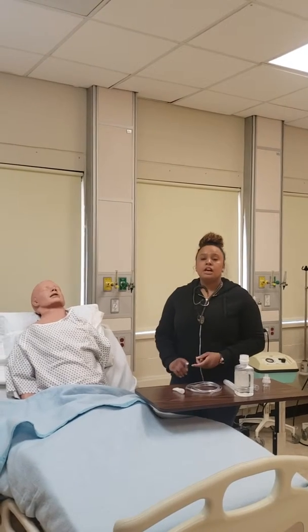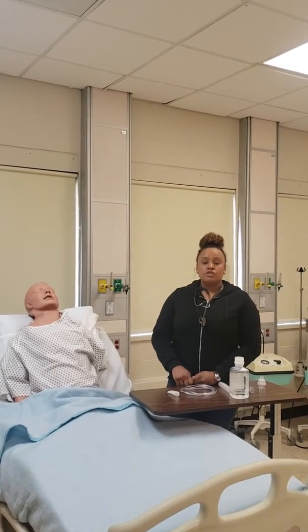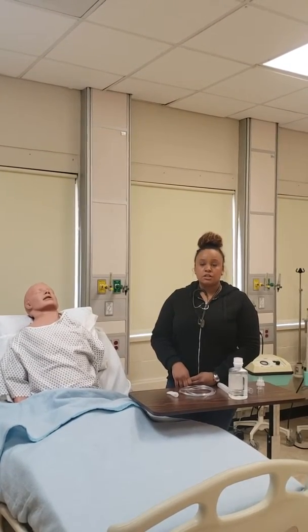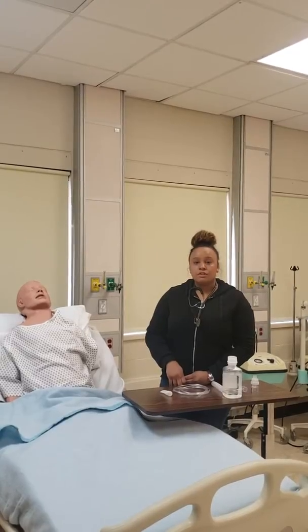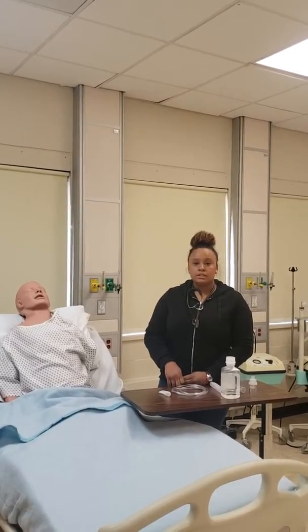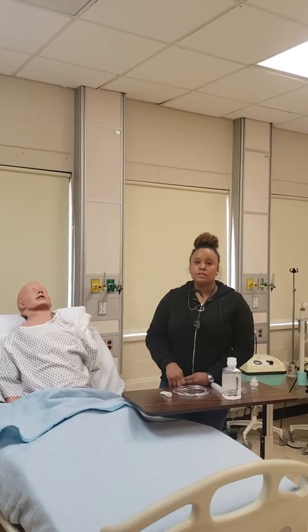Okay. At this time, I will measure the patient's pulse, respirations, saturations. I will assess the patient's color, level of dyspnea. I will also assess the patient's breath sounds and note any unexpected sounds by lobes and segments.